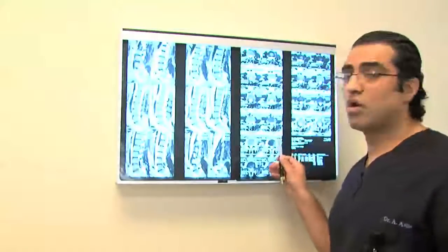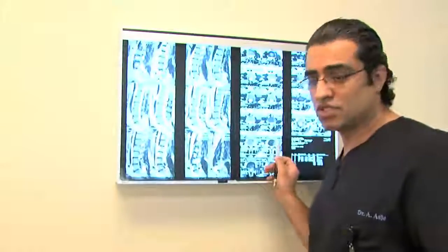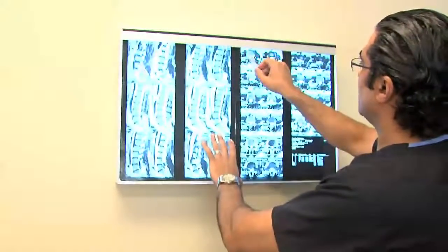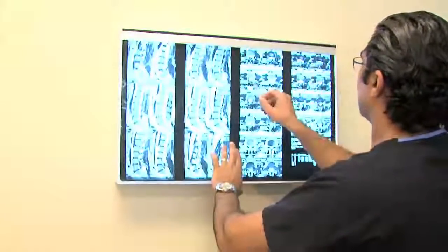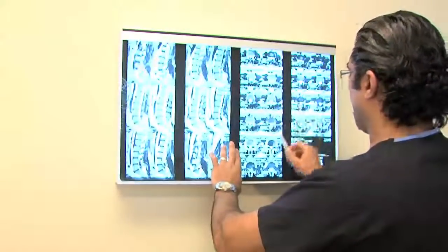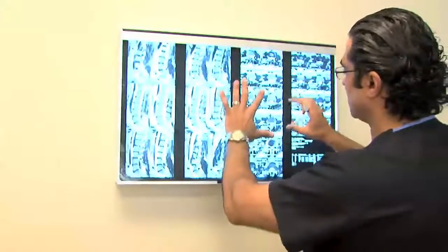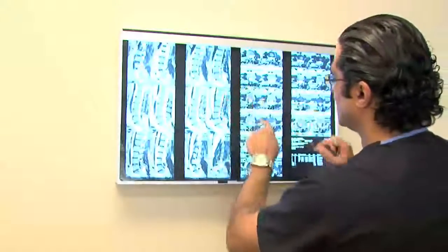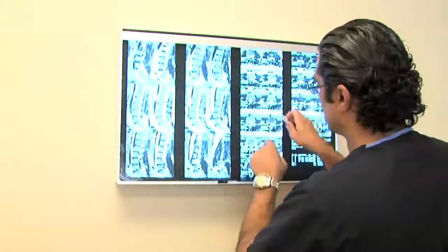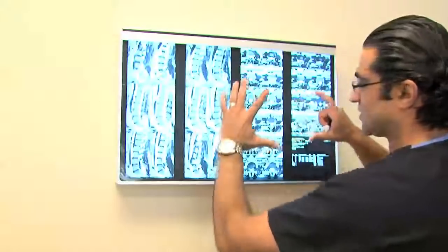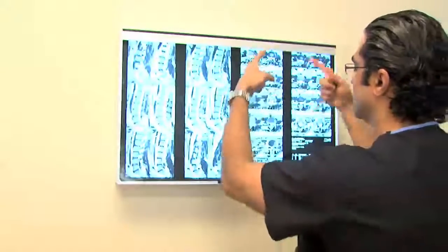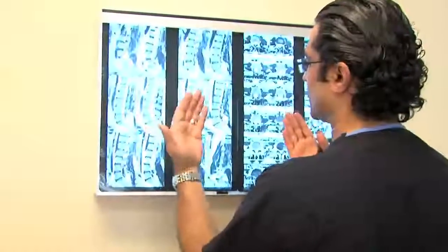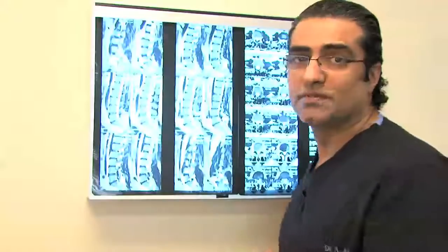This is an example of what we call the axial views — these are horizontal cuts. Looking at these images, it's coming down from L3, L4, L5, and this is S1. As you look at any image, this is the waist, this is the right side, this is the left side. You can see at the cross-sections the patient's legs are sticking out and the body is on the other side. By looking at the spine in two different aspects, you can locate and see what could be the pathology.